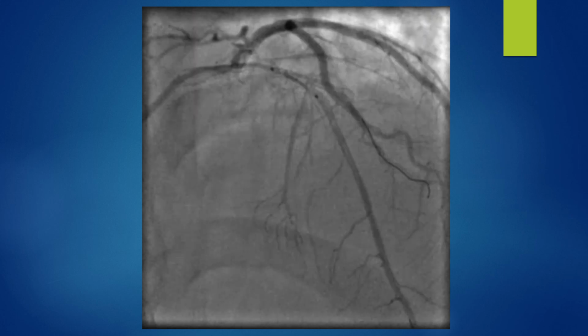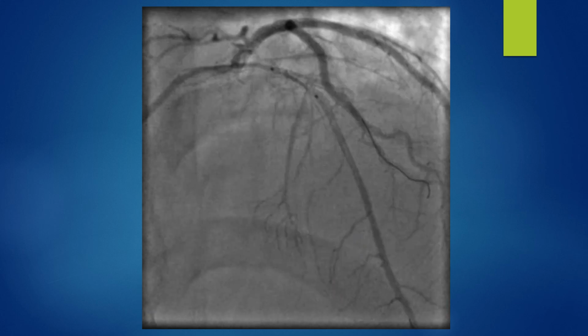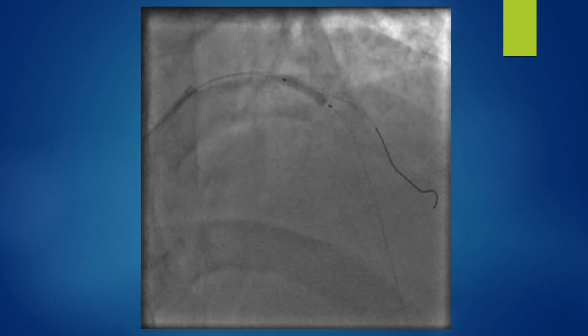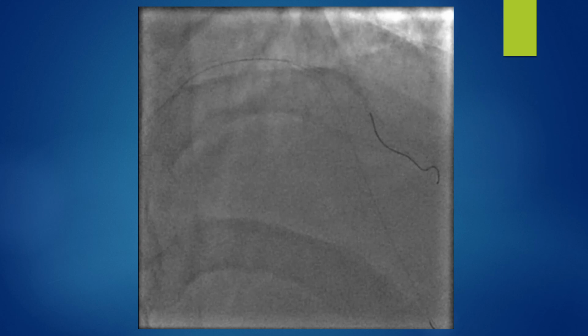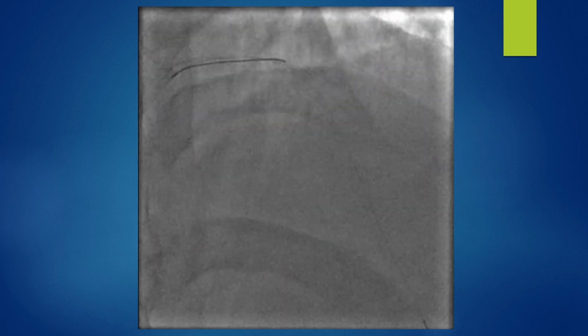Then I positioned the drug-eluting stent in the LAD, which is a 2.5 by 12 mm drug-eluting stent. I deployed the LAD stent. Then I pulled back the wire from the diagonal branch out of the diagonal stent as well as the LAD stent.